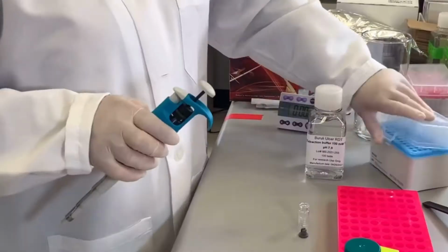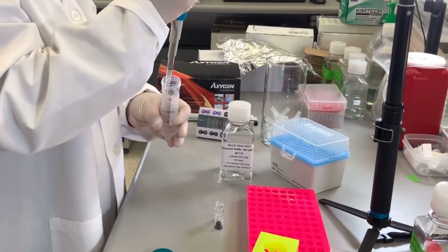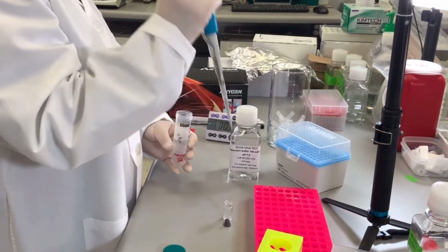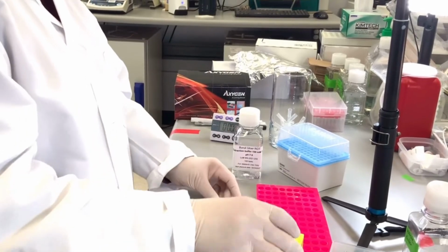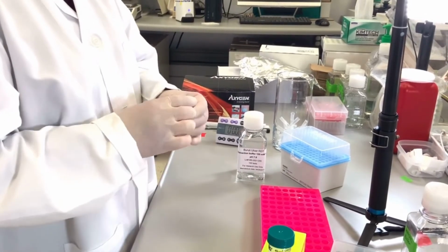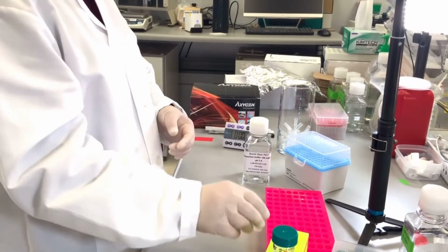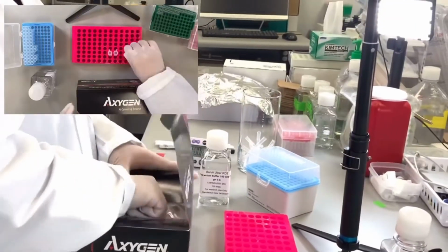First, a vial of nanoparticles is reconstituted by adding 300 microliters of deionized water, which is provided with the test, and solubilized for 5 to 10 minutes with gentle mixing. Make sure that all the material on the walls is solubilized. Each vial contains material enough to run 5 tests. Unused reconstituted nanoparticles can be stored at 4 degrees Celsius and used up to 2 weeks after reconstitution.